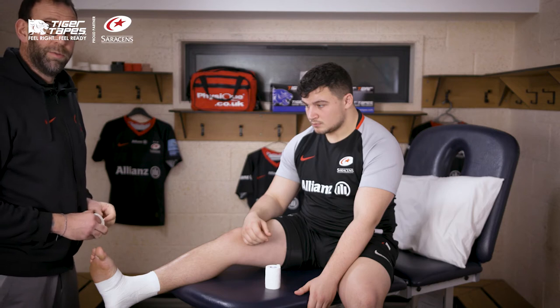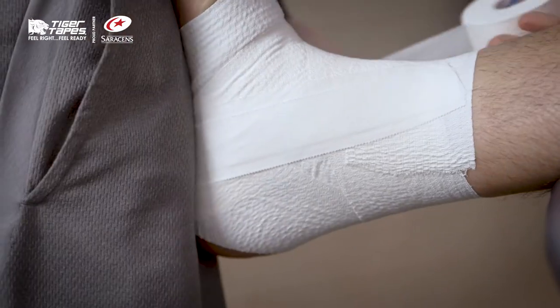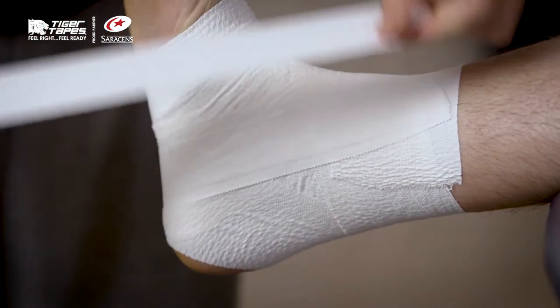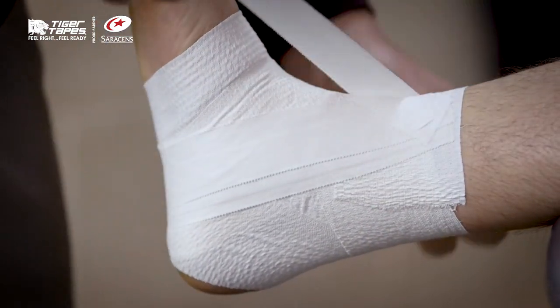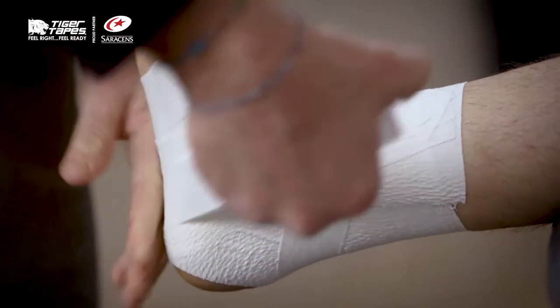You can then reinforce that with the Tiger Tape Zinc Oxide. You might just want to put it into the neutral position as you're strapping. You can do a heel lock around the back of the ankle to support the subtalar joint.